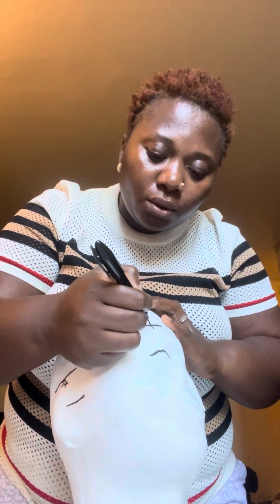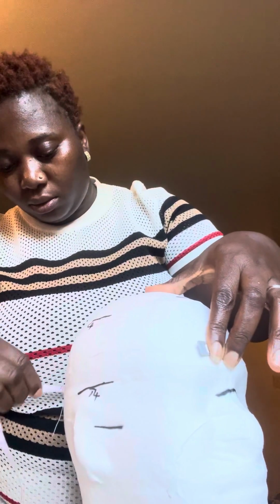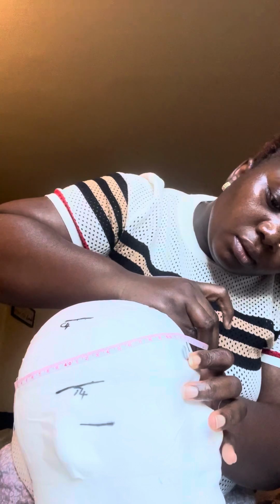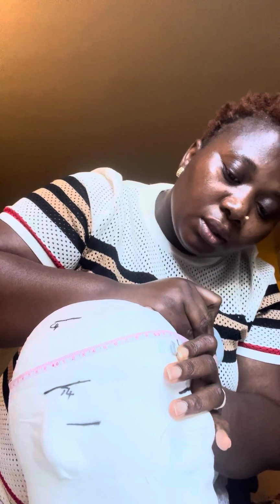So we'll take the midline of the nose so we can get the circumference of the head. It's 53.